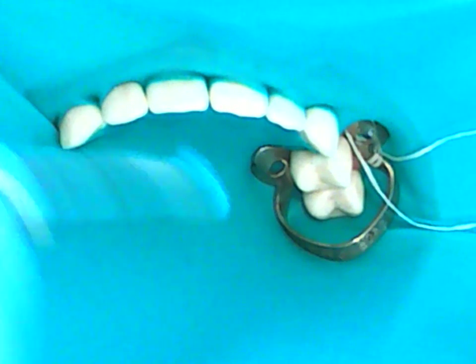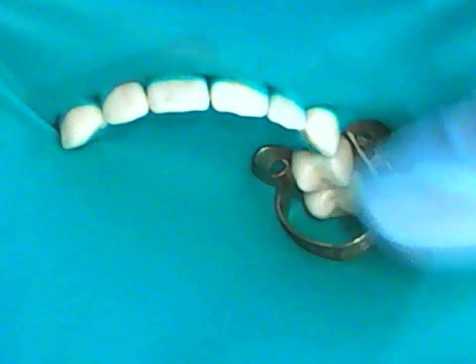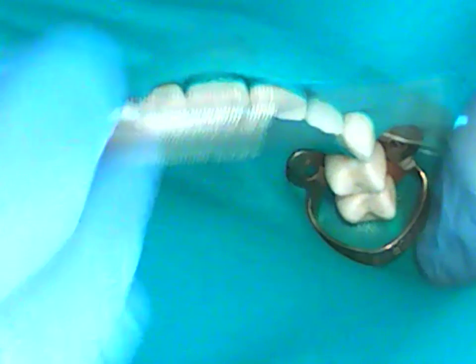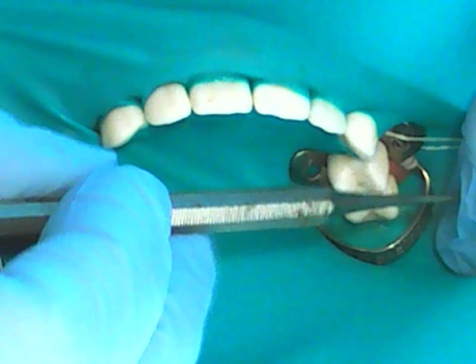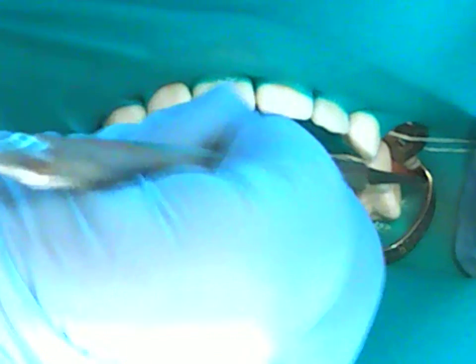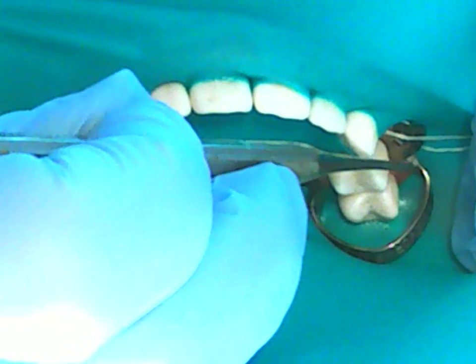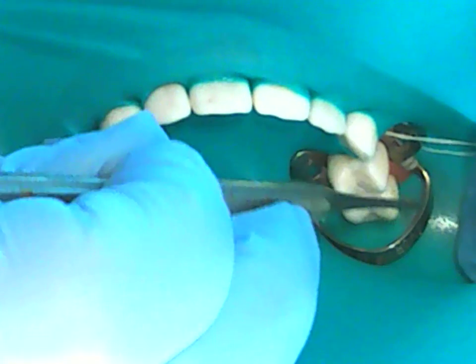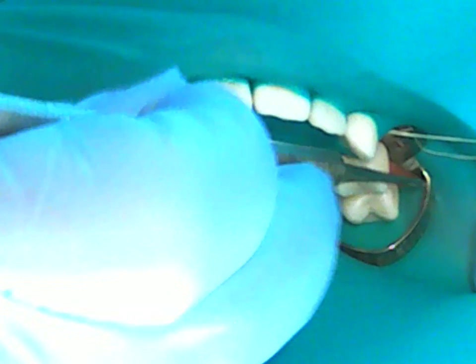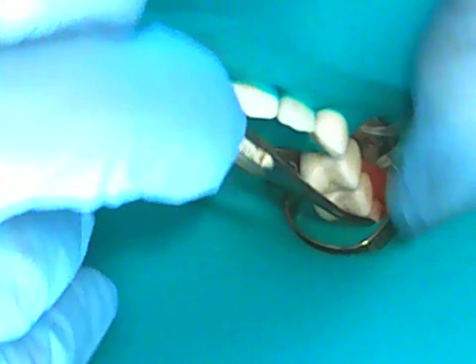The best way to do that I know of is to just retract your dental dam with your thumb and finger, and you see how you just opened up a space right back there where you can get your flat plastic instrument underneath that open area. When you do it, try not to poke the dental dam. It will cause a tear. Slide the flat plastic instrument underneath the dental dam up to the handle and just guide it up and around this tooth.